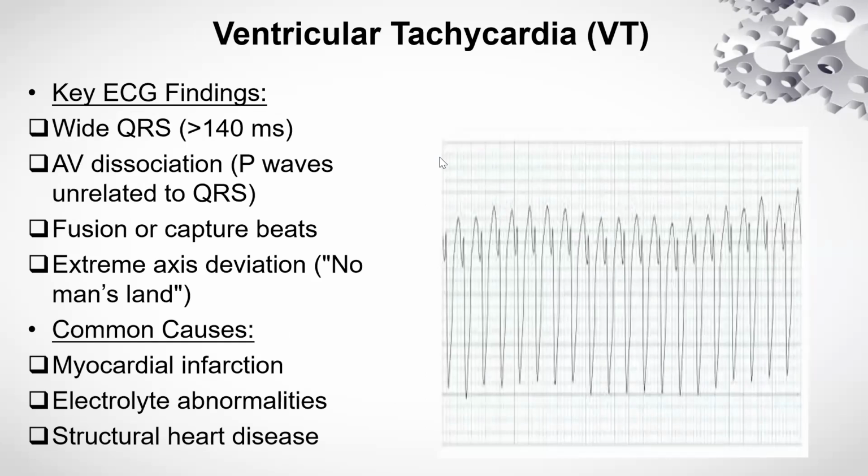Let's look at these life-threatening wide QRS complexes, the ventricular tachycardia and the ventricular fibrillation, because these are some of the things you will come across more regularly. Most of the bundle branch block, axis deviation, chamber enlargements, your cardiologist can help. You can still have time, but recognizing atrial fibrillation, SVT, atrial flutter, ventricular tachycardia, and ventricular fibrillation are very crucial in the critical care settings.